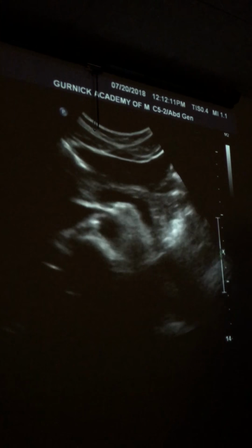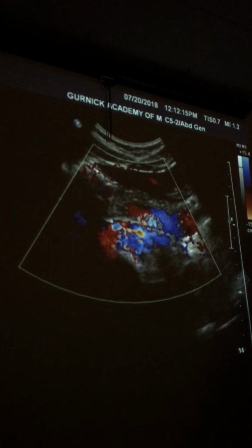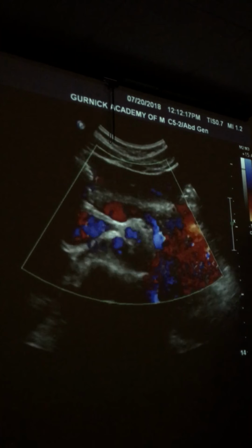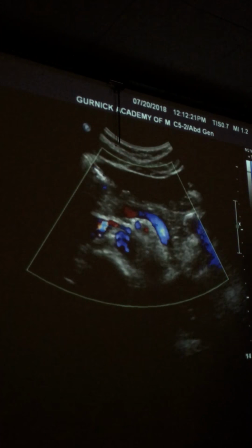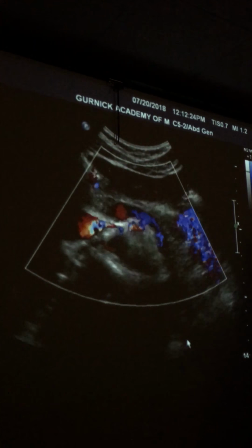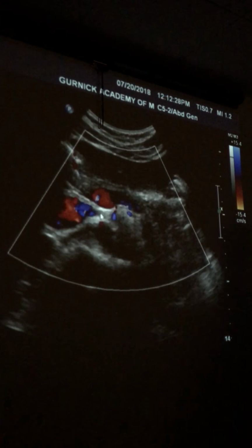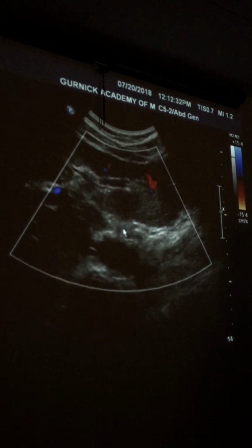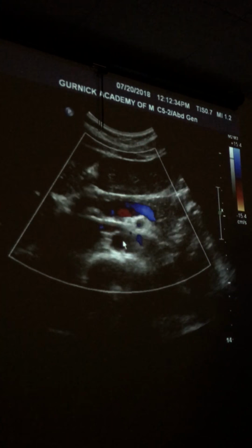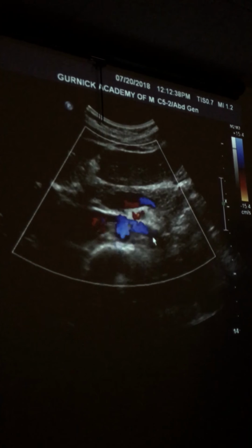Now, the other pitfall is what? Sometimes you guys are mixing up, and everybody does this, you're not that special, sometimes people mix up the splenic vein and the left renal vein. So, if I'm looking at my splenic vein right here, I should know that my left renal vein is going to come right across here. Little breath in and hold. It's going to come right through here, right? So this is going to be my left renal vein.